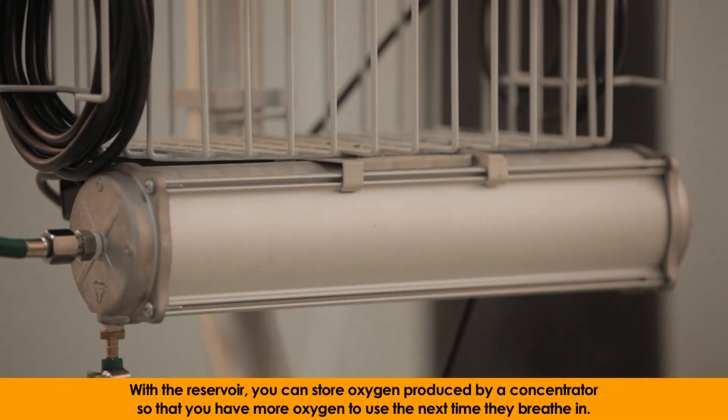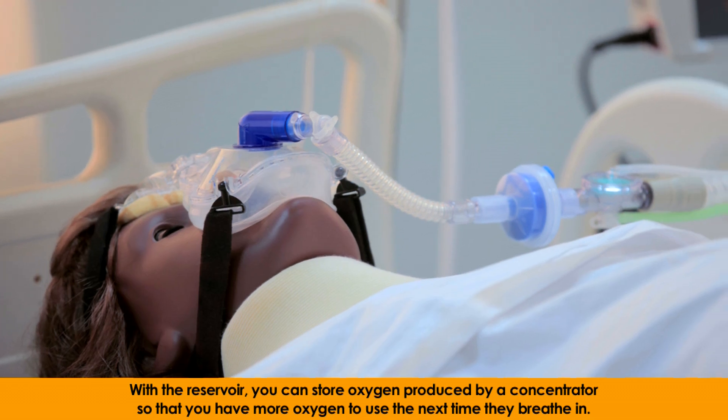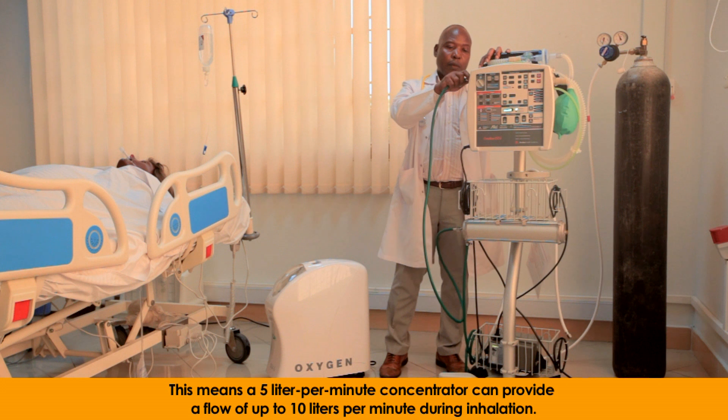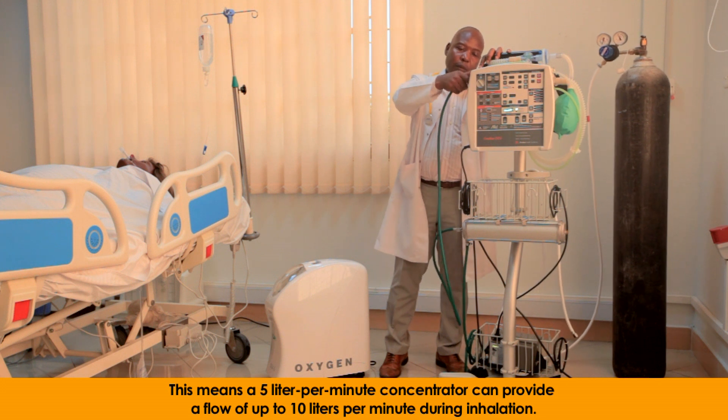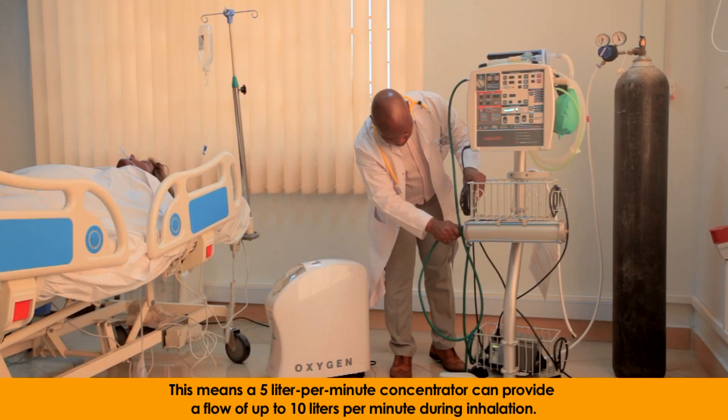With the reservoir, you can store oxygen produced by a concentrator so that you have more oxygen to use the next time they breathe in. This means a 5 liter per minute concentrator can provide a flow of up to 10 liters per minute during inhalation.